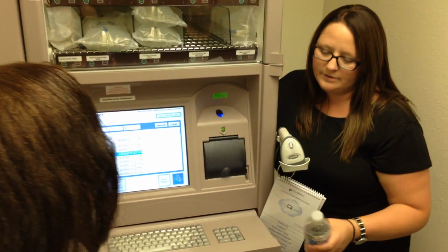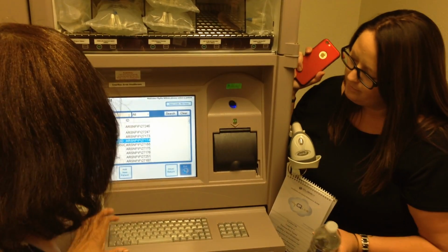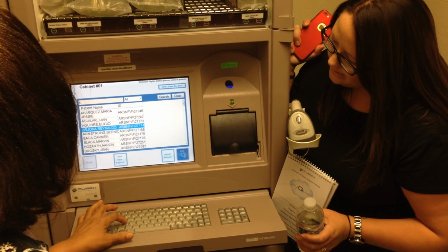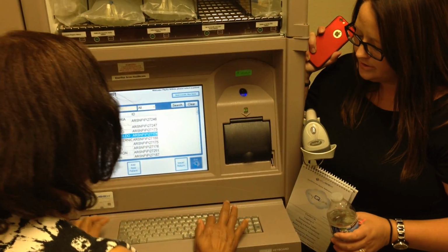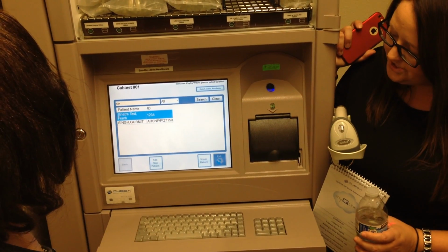We're going to take some stuff out today for Frank Sinatra. So go ahead and search for him, please. That's our test patient's name. Yep, right there. S-I-N. Perfect. And then you want to hit enter or search to narrow your results. Then you'll tap on his name and hit issue return.